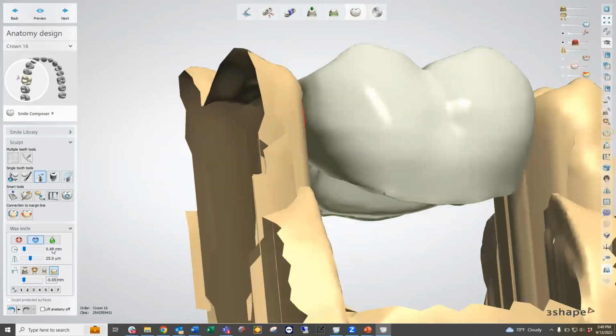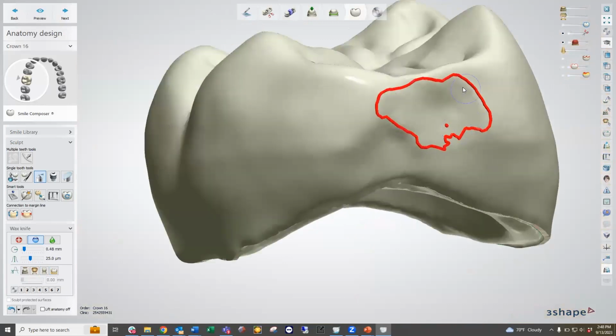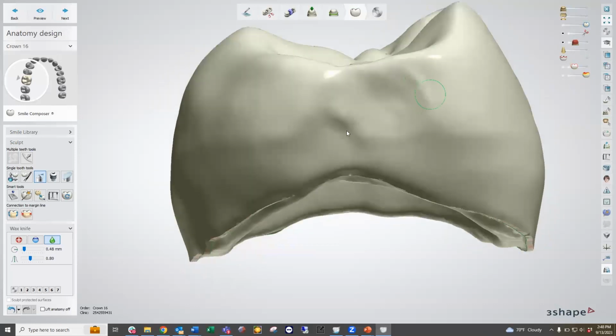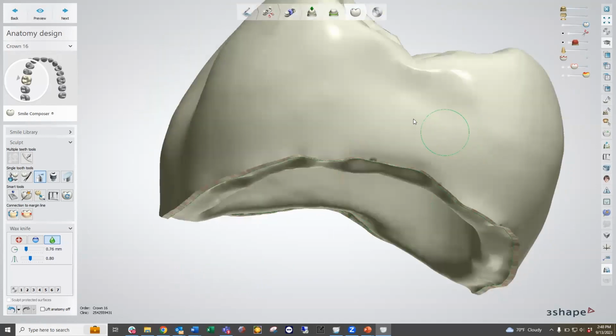And what's left is, if I go ahead and uncheck this and remove all my models so I can see just my contact, we can now see our contact relative to the contact lines that we see here. And I'm going to go ahead and just smooth these areas out, because if we take off those contact lines, you can see a finite line around our unit. I don't like to see that line. I like to have it disappear into my unit, but I know that it's going to be heavy. It's going to be a nice solid contact in that area. So I'm not going to change anything inside that area that I know is there. I'm rather just going to develop the outside areas to blend more so with my unit. Okay, again, over here, I'm going to go ahead and just blend those areas in with my unit, being careful not to make more of my changes on the interior aspect of where that contact was.